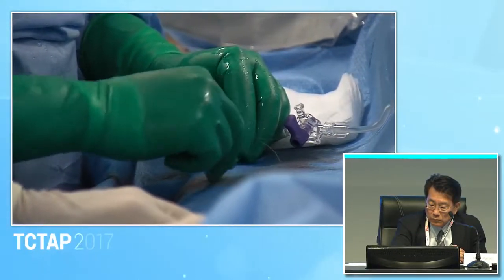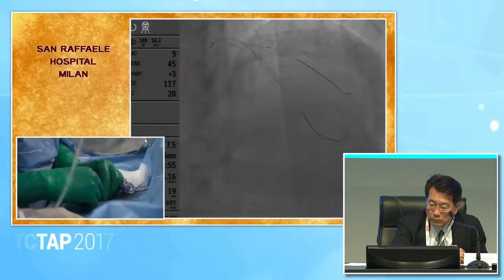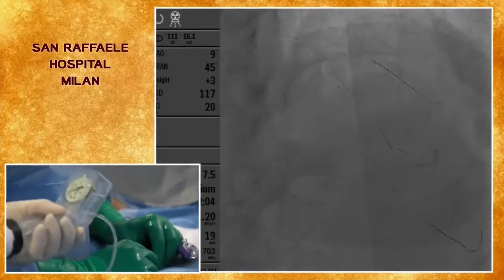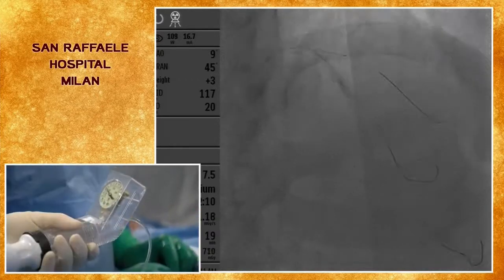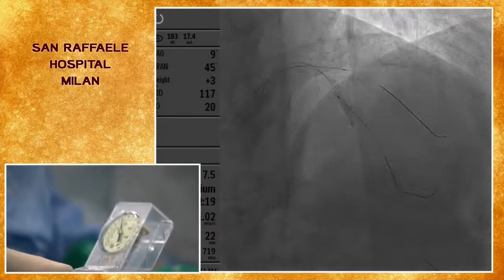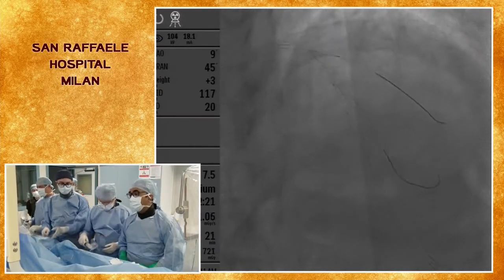Okay. So we are going first in the diagonal. Well, first we're going to go towards the LAD, right? And open up the struts. Well, we stay here until 5. Okay, so good. It opens pretty well. We can inflate because the stenosis on the LAD is not severe. So when I do single inflation, we go to 12, not too much. We don't want to dissect. Yeah, it's a non-compliant balloon again. And we tend to do most of our kissing inflation with two non-compliant balloons, right?